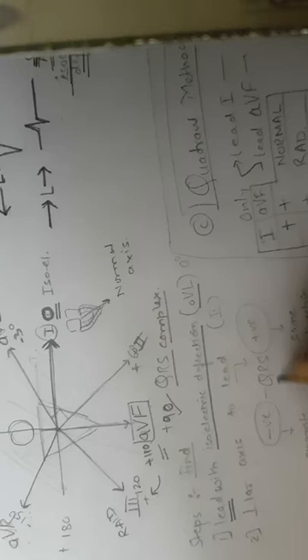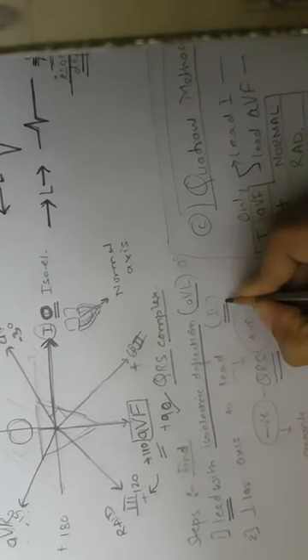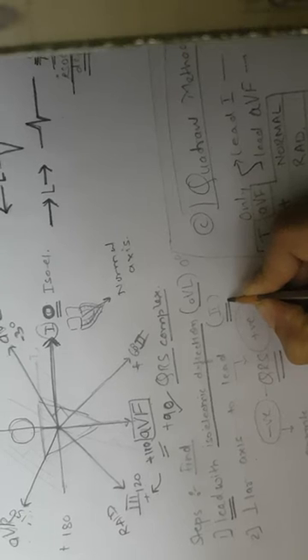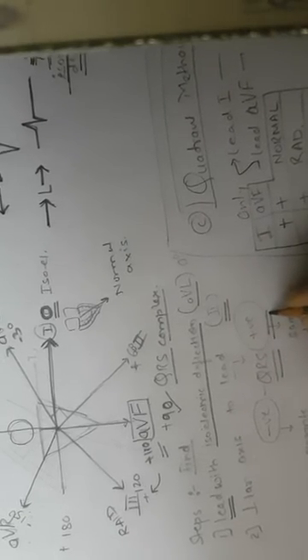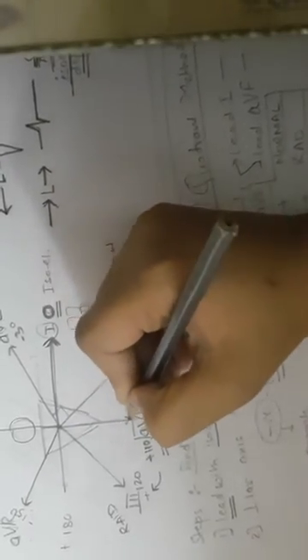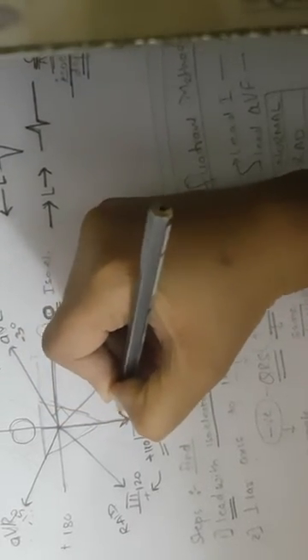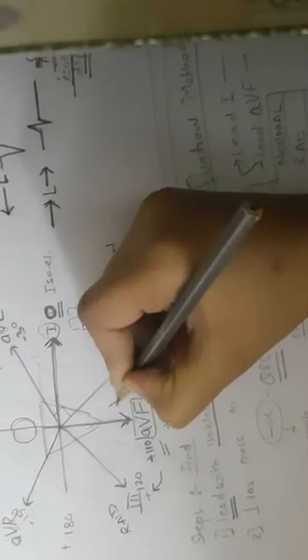If the QRS complex in this perpendicular lead is positive, then the current is flowing in the same direction, which means the cardiac dipole is in this direction.